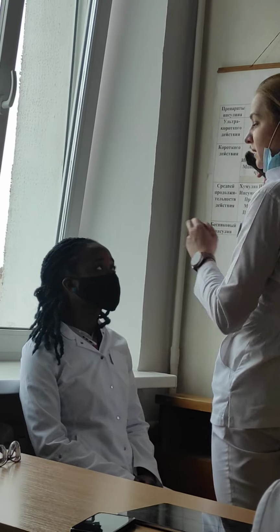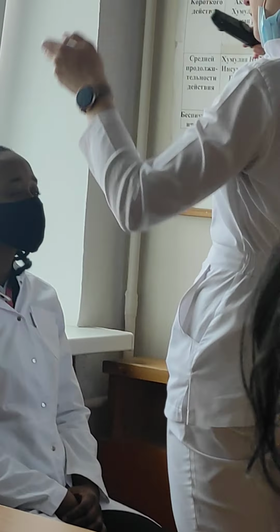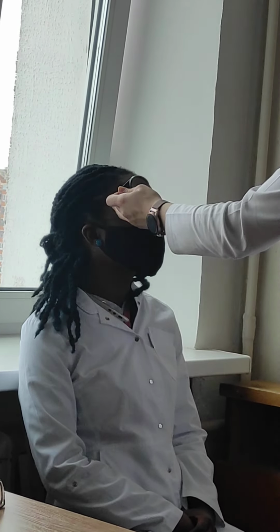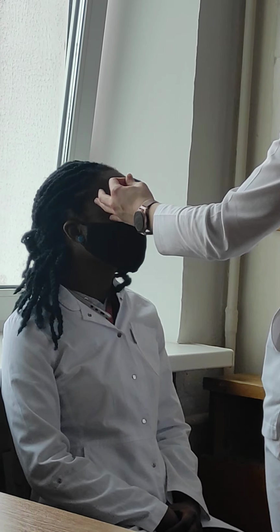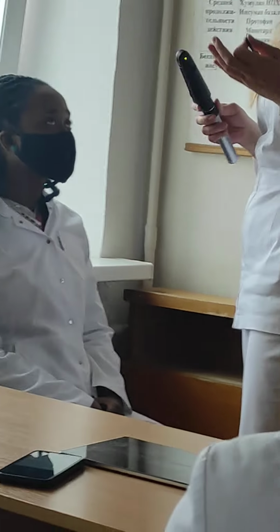Then we send the light inside of the pupil and try to see the red reflection from the eye fundus. As soon as we see the red reflection, we put our lens between our eye and the eye of the patient, and move it back and forth, trying to see some details of the eye fundus.